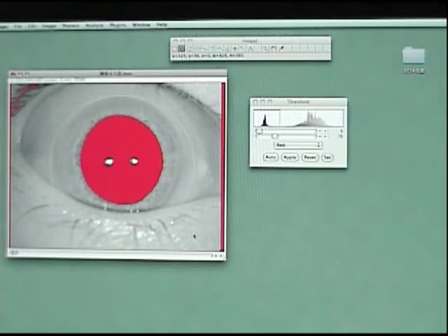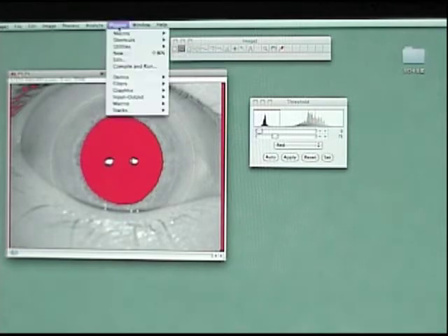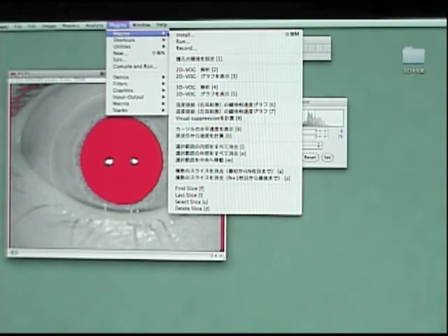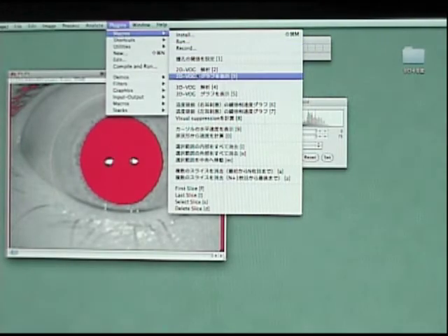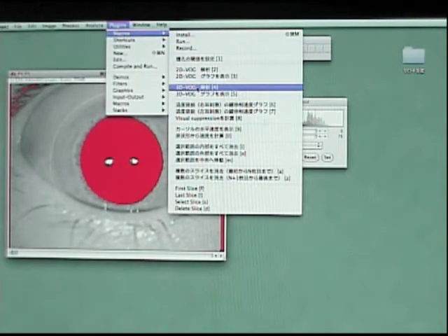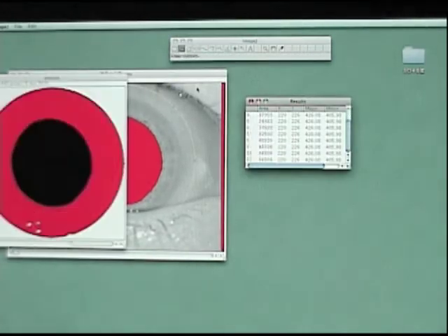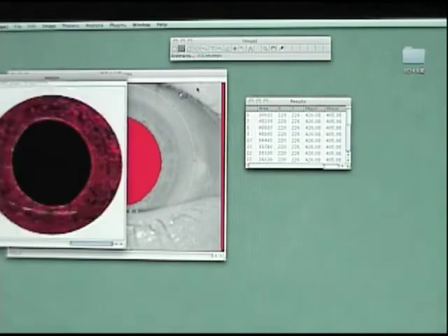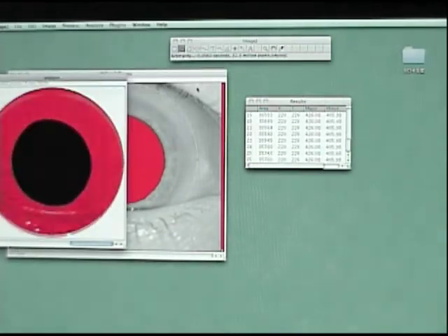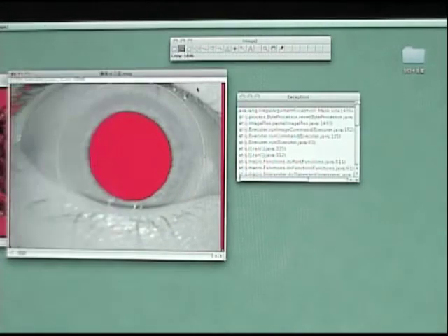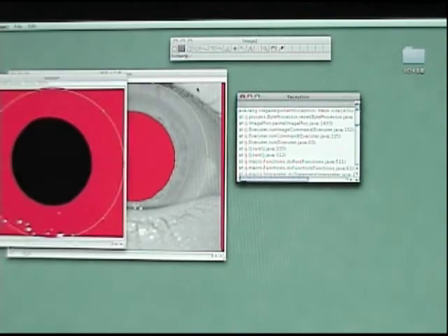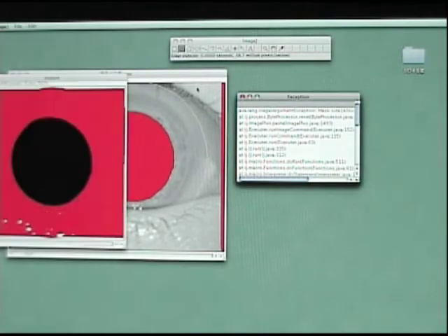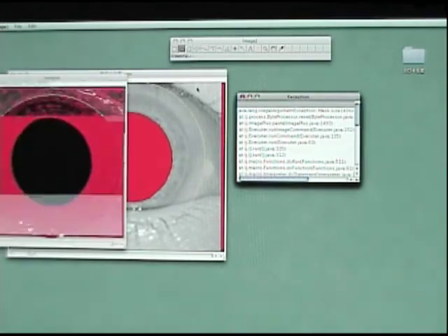Using circle tool, surround the pupil like this. And select the 3D VOG analysis from macros menu. It takes about 3 minutes to analyze for a second movie.